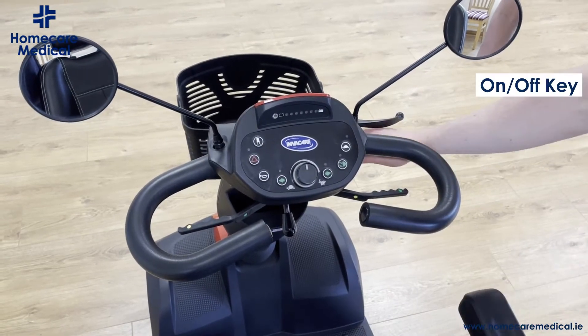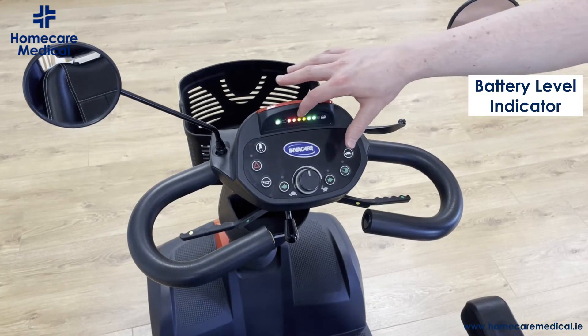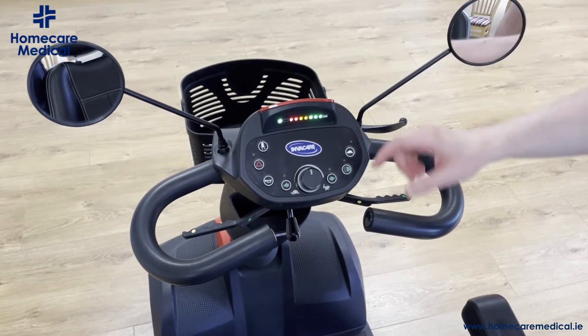To operate your Orion scooter, you have the key here on the right hand side of the handlebar. If you turn it on, it'll activate the power indicator, letting you know how much battery life you have left.